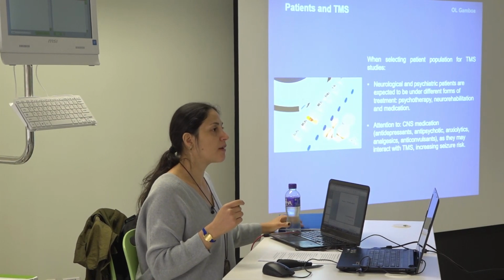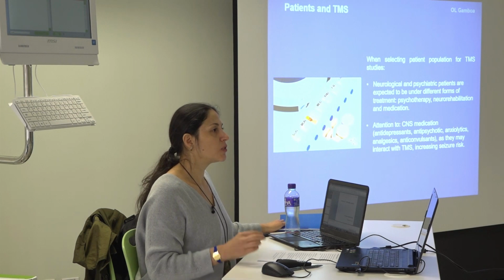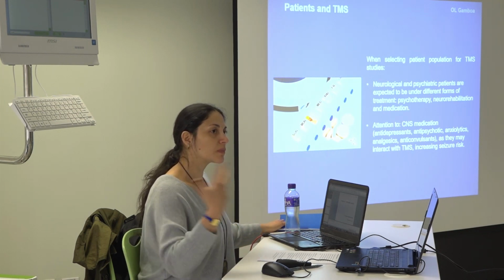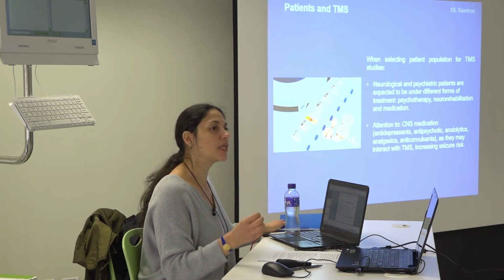In the United States, I have seen a lot, which is strange for me, because I've been in Germany, in many countries, and I didn't have the situation of finding it among healthy participants. It was very easy, but in the United States, many of them are medicated with anxiolytics, antidepressants, and you have a lot of marijuana around. So, okay. It's a suggestion. Probably here you don't have that problem, but you want to consider it, right?